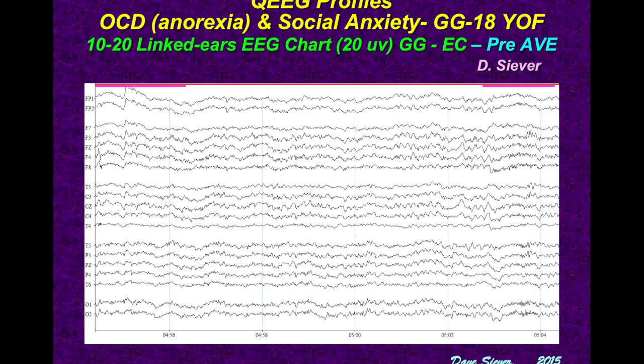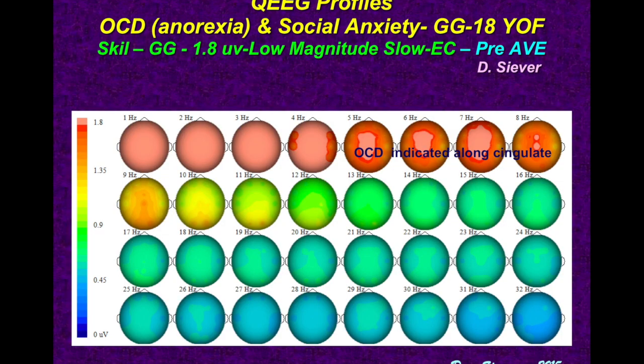And when we look at her brain waves here, we see a lot of it is very choppy again. She does show a little bit of a rhythm at the 5 minutes and roughly 1 second to 2 seconds. There is a little bit of stuff that goes on, but it's mostly clamped out throughout most of her recording. And this is the microvolt scale, and bingo, look what we see down the middle. Yeah, we see slow activity following down the cingulate primarily.